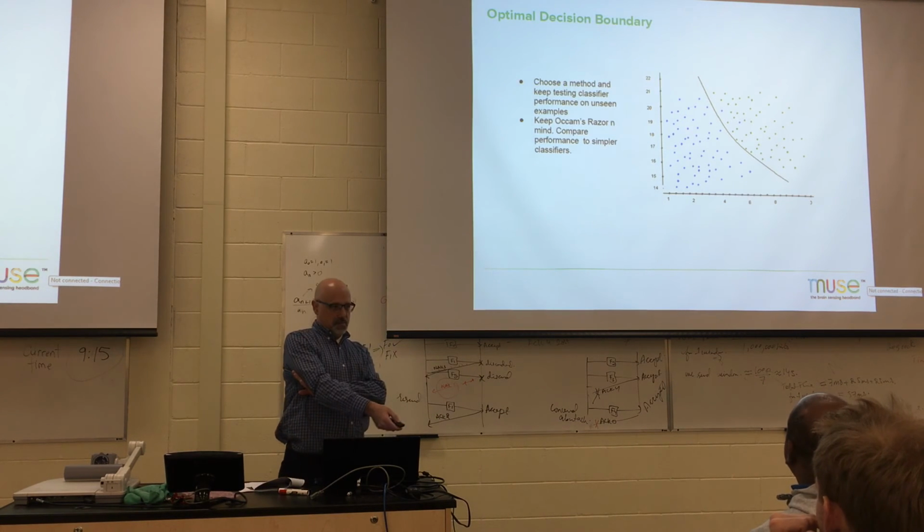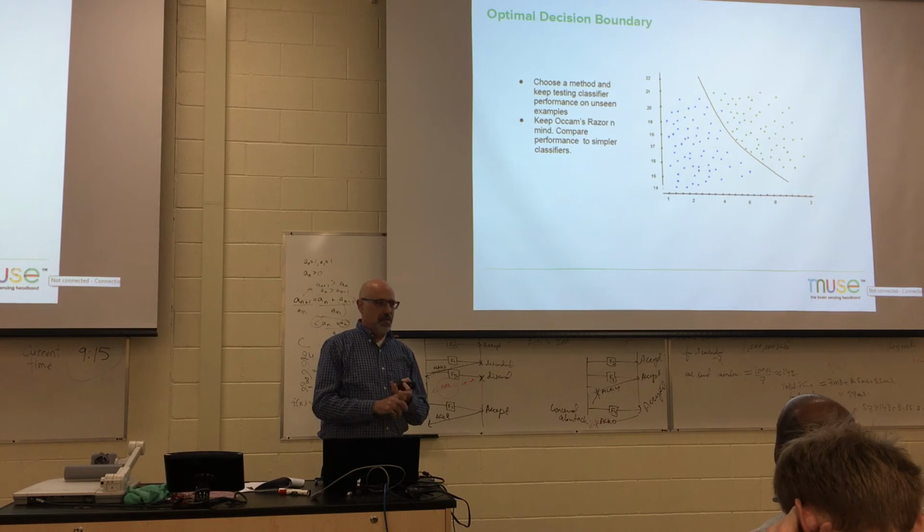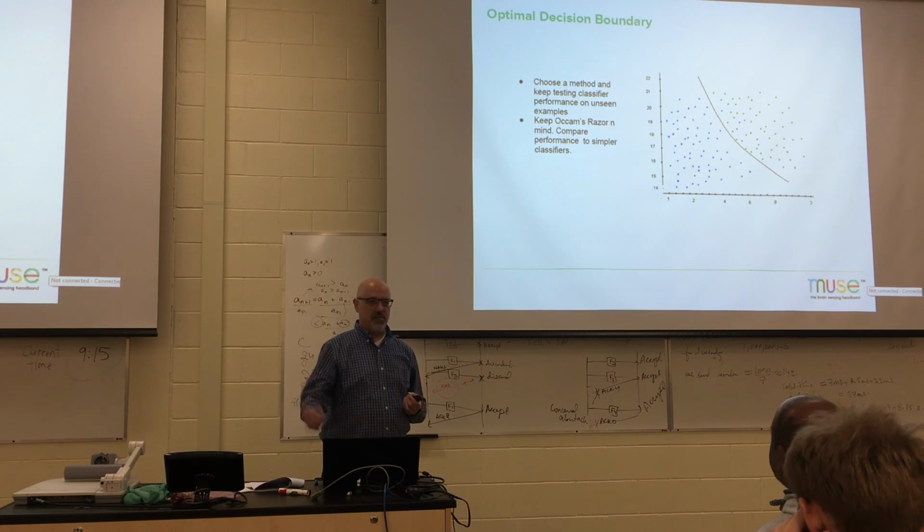And so to get back to your question, deep learning, if you have lots of data and lots of computing power, it will learn the features, right? Whereas what I've been telling you today is you need an expert with domain knowledge, who knows what the signals mean, to help build a classifier and choose the best features, or another way is just keep throwing features at it until you find ones that work well.